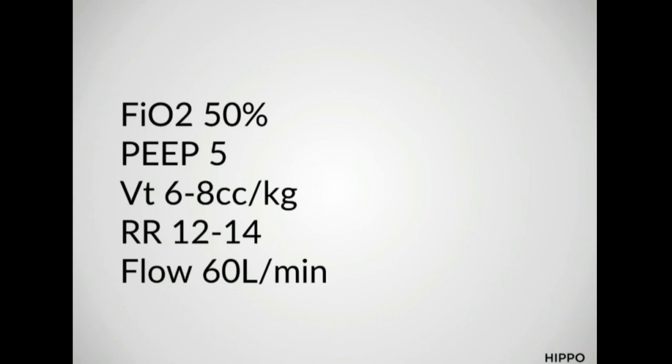So if you start at 60 and your patient still looks air hungry, maybe you turn them up to 70 and see how they look. Even 80 might be about as high as I would go on the standard patient. You can also go down a little. You could go down to 50 or 40 if they seem like they're getting blown away by whatever you've set. All right.